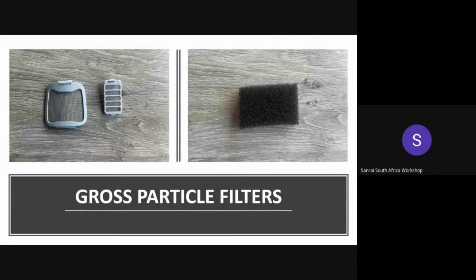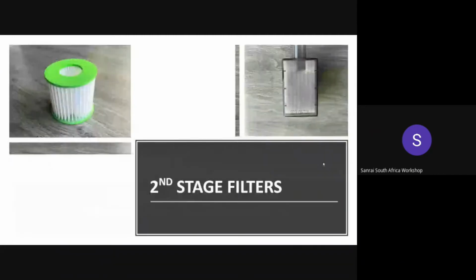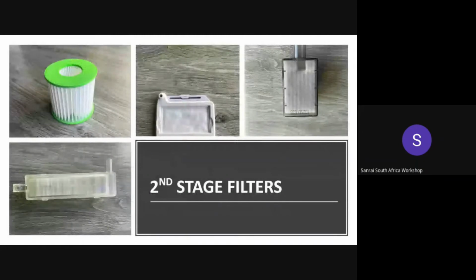Second slide, please. Secondly, we have the inlet filter. Those are your HEPA filters, the paper filters.